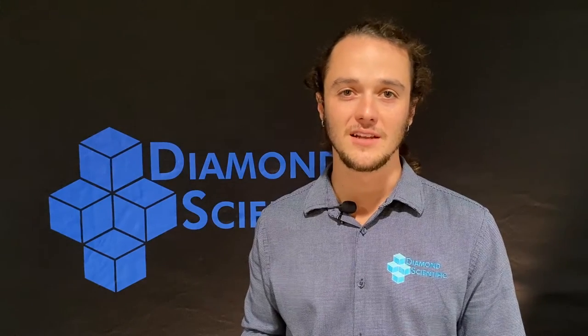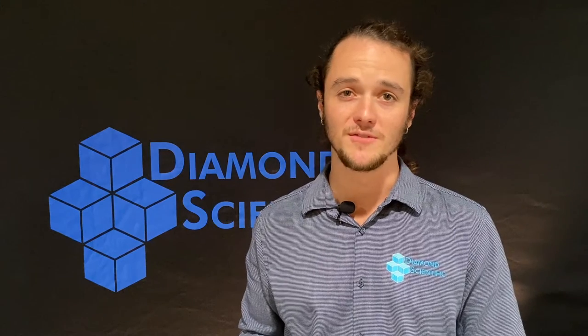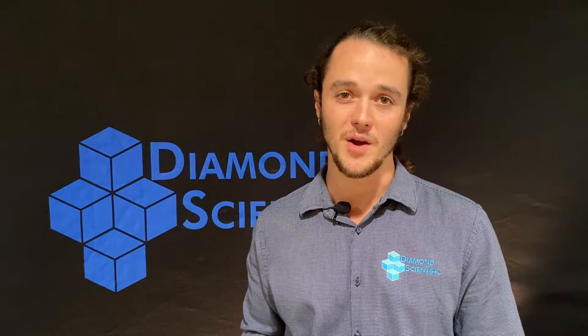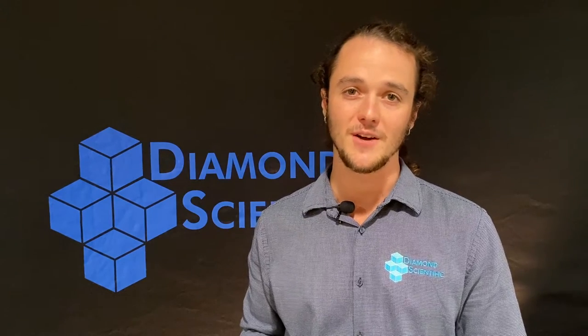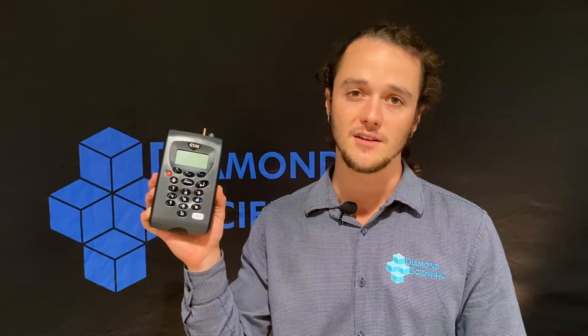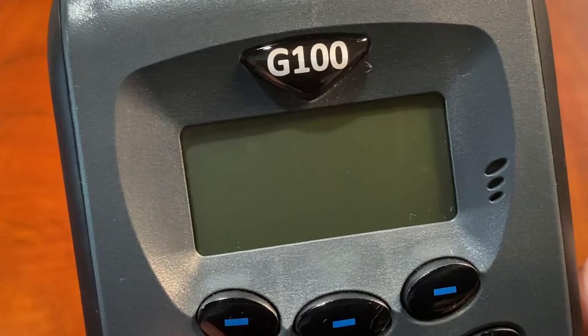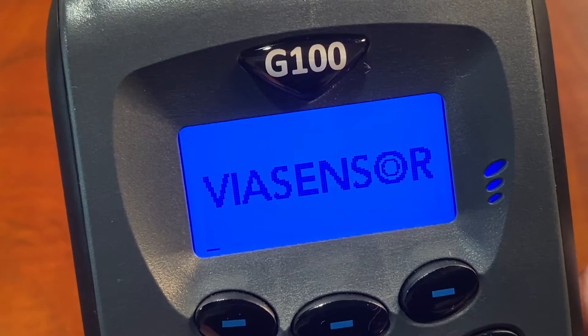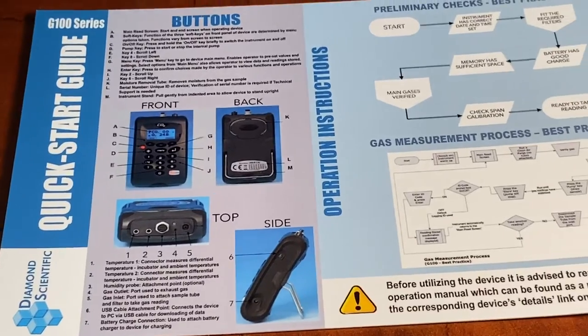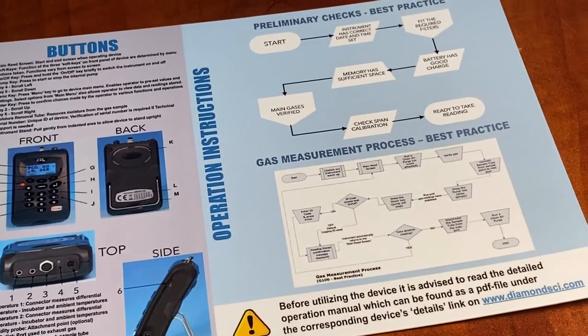Hey everyone, thanks for tuning into the Diamond Product Series. I'm Shane with Diamond Scientific, your go-to for biogas analyzers, pumps and accessories. Today we wanted to show you the Via Sensor G100 series carbon dioxide incubator analyzer. The G100 series is ideal for in vitro fertilization, medical, and other laboratory applications, with quick verification of carbon dioxide levels.